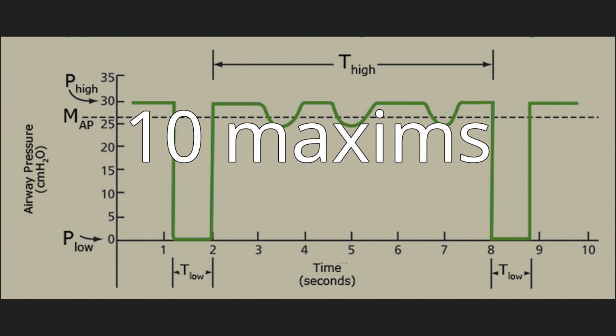Setpoint, a targeting scheme for which the operator sets all the parameters of the pressure waveform (pressure control modes) or volume and flow waveforms (volume control modes). Dual, a targeting scheme that allows the ventilator to switch between volume control and pressure control during a single inspiration. Biovariable, a targeting scheme that allows the ventilator to automatically set the inspiratory pressure or tidal volume randomly to mimic the variability observed during normal breathing. Servo, a targeting scheme for which inspiratory pressure is proportional to inspiratory effort.